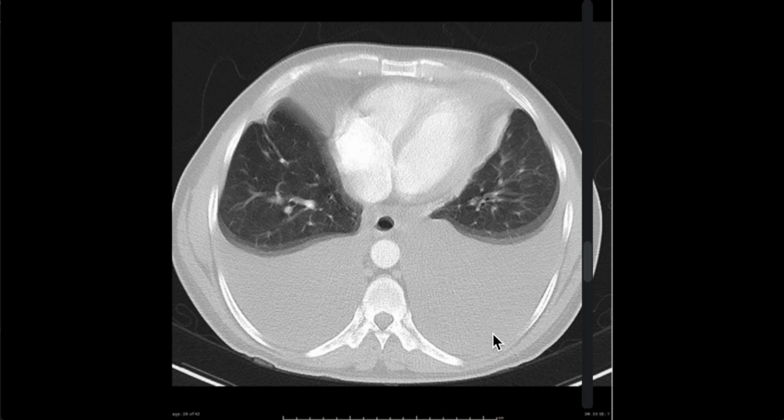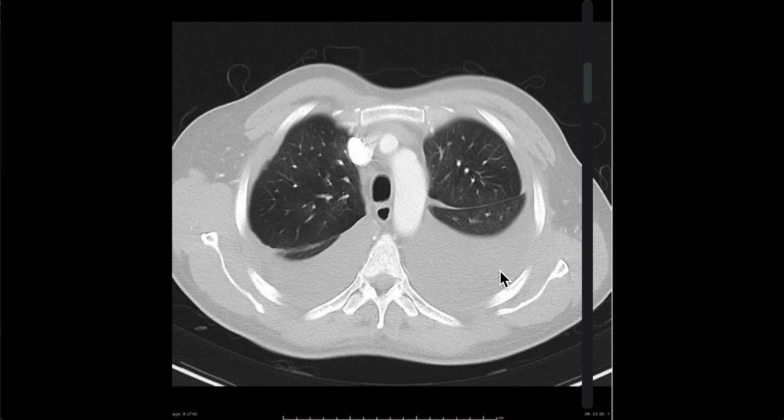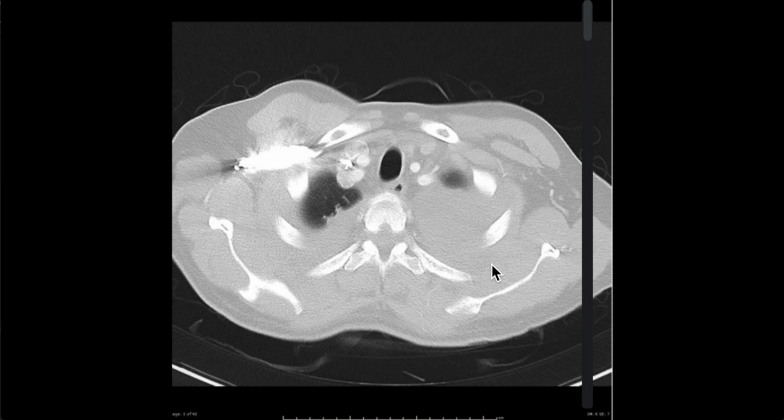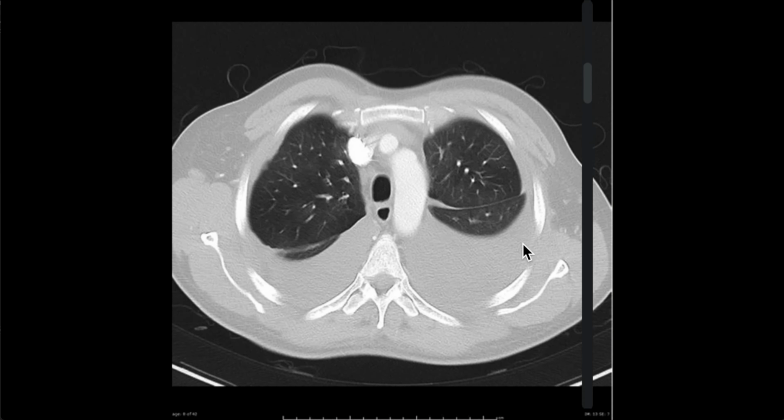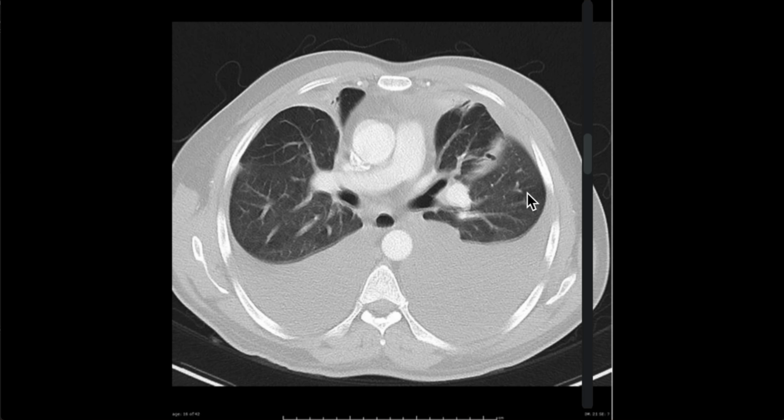This is another patient where we can see they've got bilateral pleural effusion, so they've got some liquid or fluid on both sides of the lungs. And actually, on this scan, there's something else. I think there may be a pulmonary nodule, and you can see there, there's a small pulmonary nodule as well.